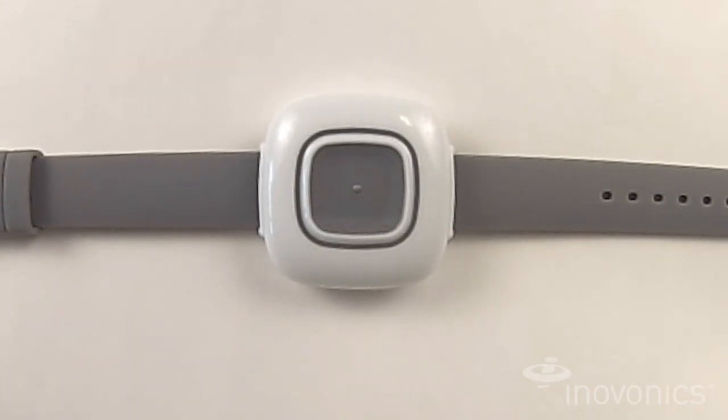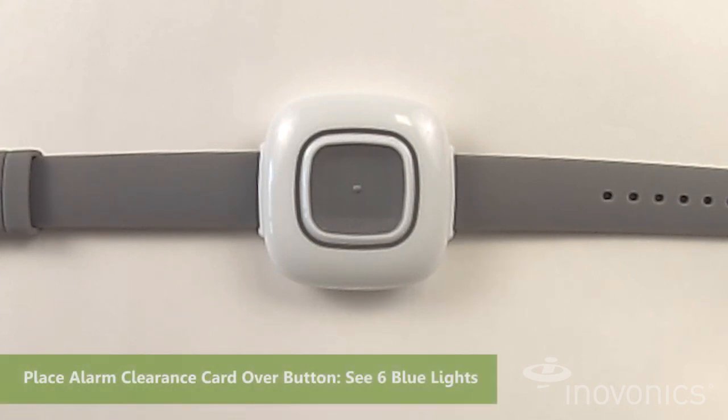To clear an alarm on the EN 1221S-60 pendant, you can use the Magnetic Alarm Clearance card, which is sold separately. To clear the alarm, simply place the card over the gray activation button. When you do that, you'll see a series of six blue flashing lights to indicate successful alarm clearance.